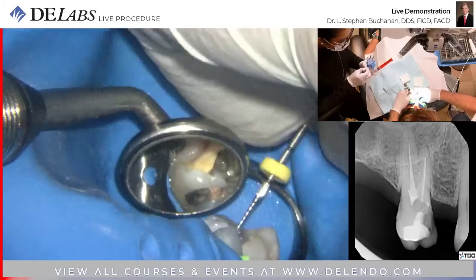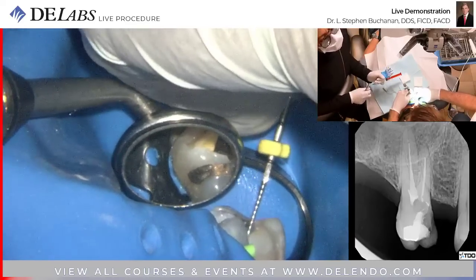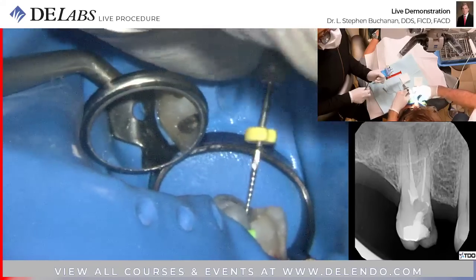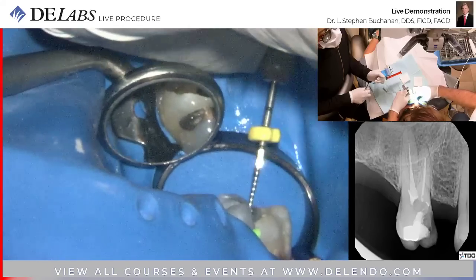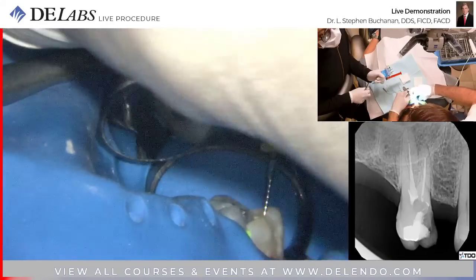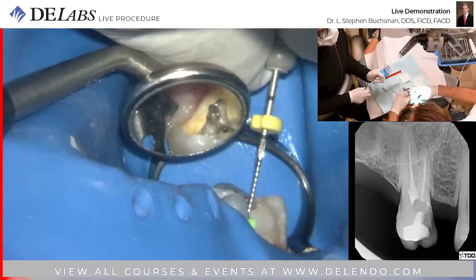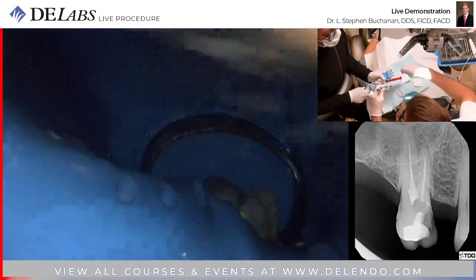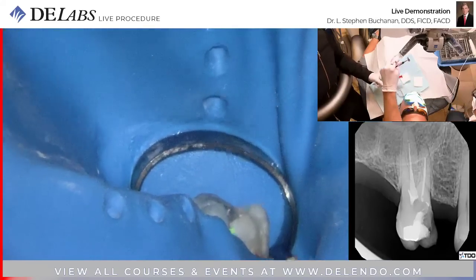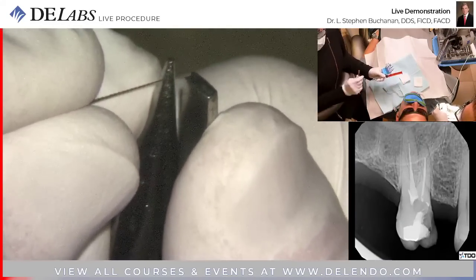Okay, never more than 90 degrees in a clockwise direction. These little files don't ever break due to cyclic fatigue, but they will break really easily on torsional stresses. I bet you $1,000 that every single one of your 6s, 8s, 10s you've broken is because you rotated it more than 90 degrees in a clockwise direction. It's really tough not to do that. I have no tug back there, so this is an impediment. Let's see if bending a file is going to get us there. The impediment is in the coronal 3 millimeters.